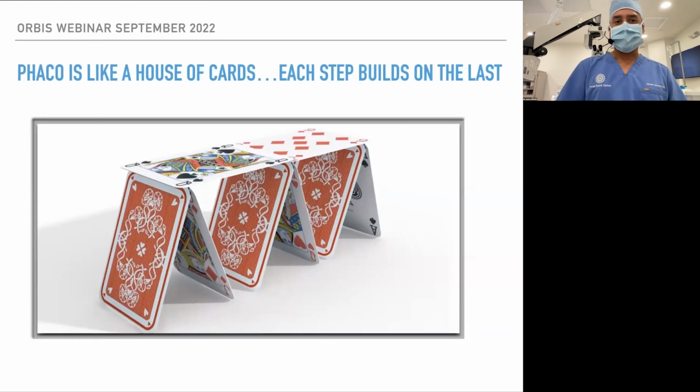Phaco is like a house of cards. This is something my boss told me when I was in residency. The first step is patient preparation. Then we're going to make the incisions. If you don't prepare the patient properly, or you don't make the incision right, it makes every subsequent step more difficult. So you've got to do everything right so that you have a chance to have a successful, quick, efficient case.